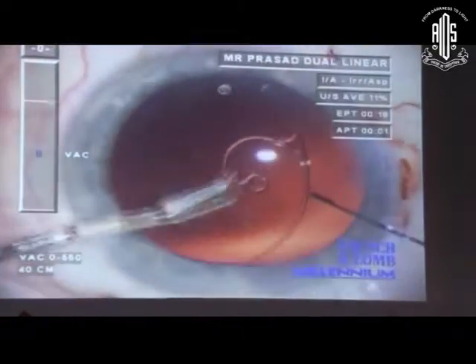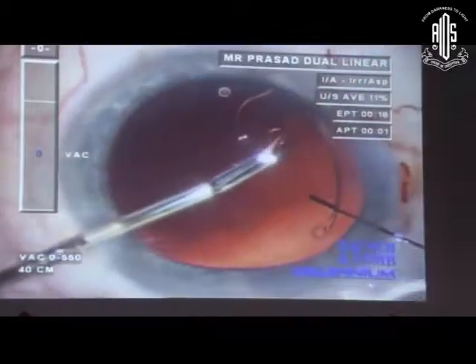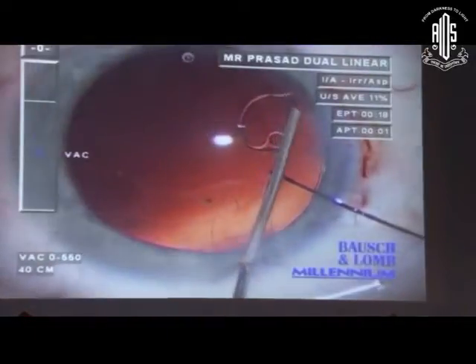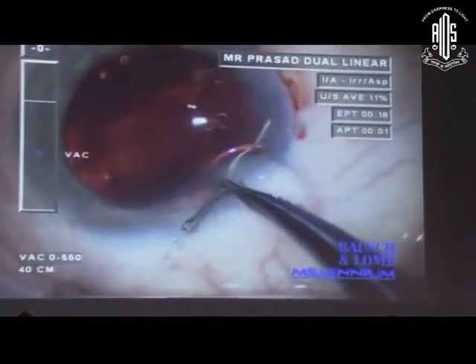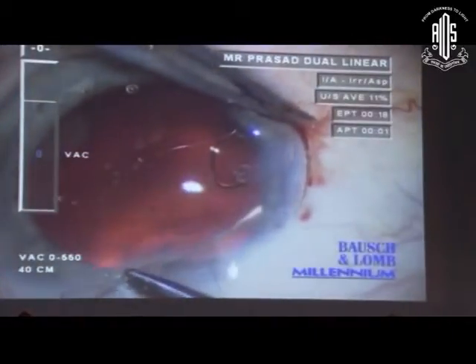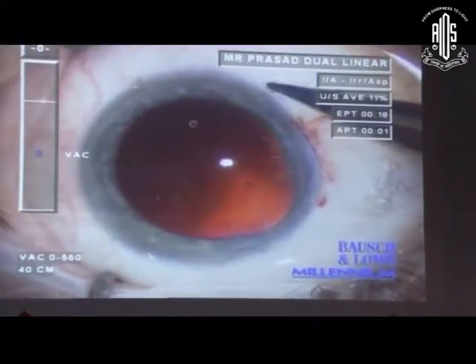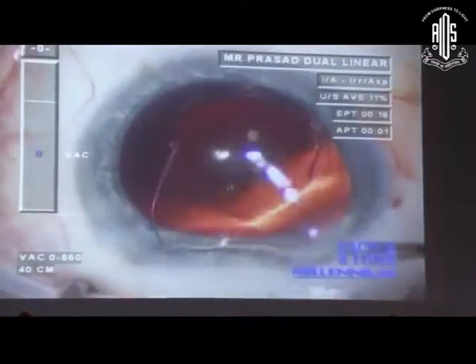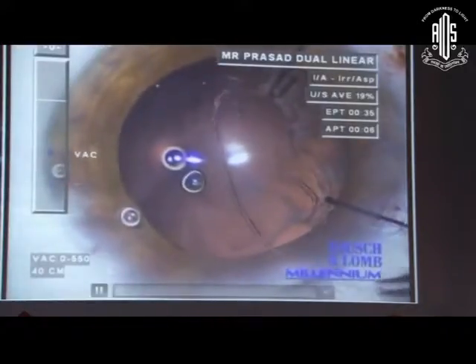Once we finish the phaco — edited out in the interest of time — we put a capsule tension segment in place. Here I've made a Hoffman pocket, and I've already made an incision for the LRI. The suturing technique: pass your needle through and through, take a loop out of the pocket, pass your other needle through and through sclera and conjunctiva, take it out, cut it, pull the loop out — so you have two ends coming out through the pocket which you then tie. That suture disappears. You've not used a diathermy flap, and you get a perfectly centered lens. I always have a three-piece backup lens as my insurance policy, in case I need to suture it later.